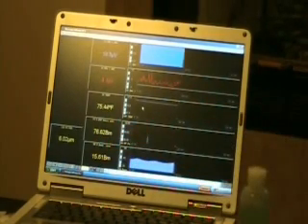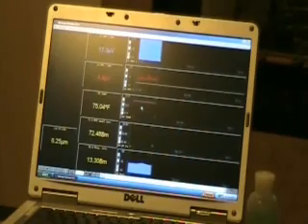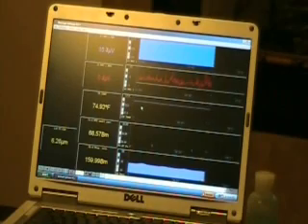So the way we check this is we very gently rub your palm. Just feather, feather light. Okay? Don't you do it. Don't you do it. Okay. Now, if you had been looking over here, what you would have seen is that when I said we're going to do it, it immediately changed. Oh. That's an emotional response to having somebody that you don't know all that well saying they're going to rub your palm. Oh, okay. So we picked it up. It's working fine. It works.